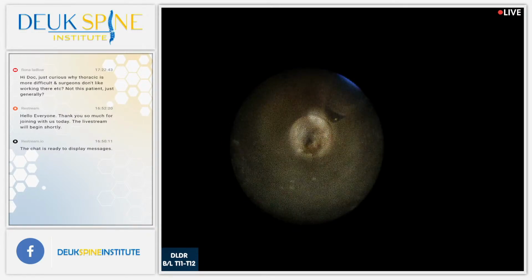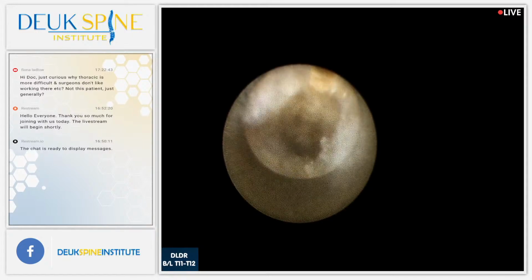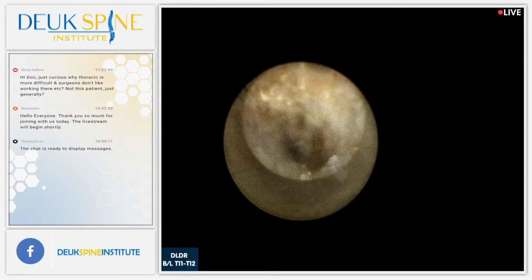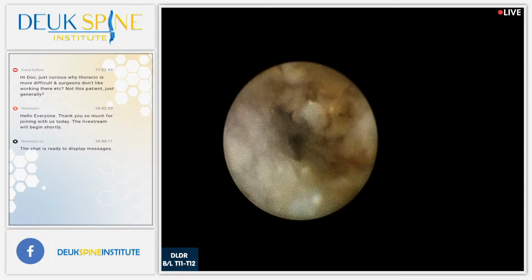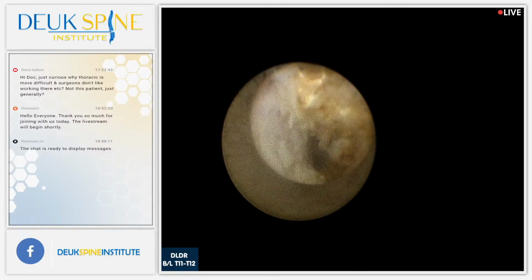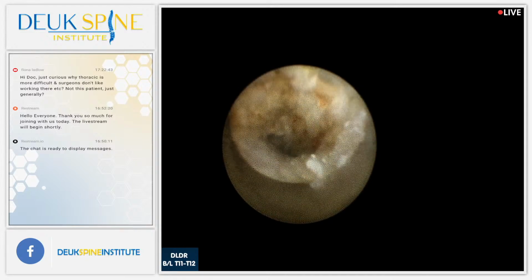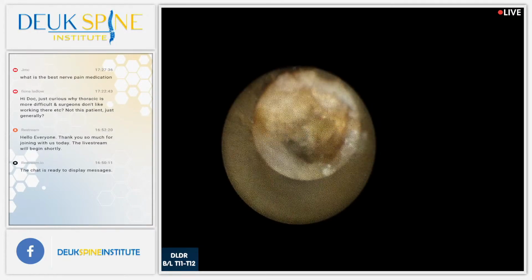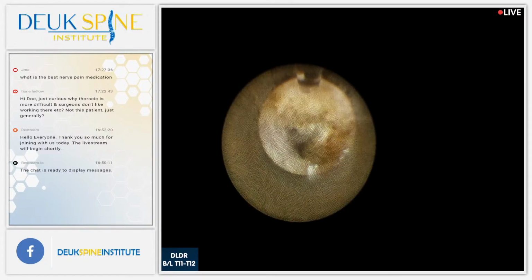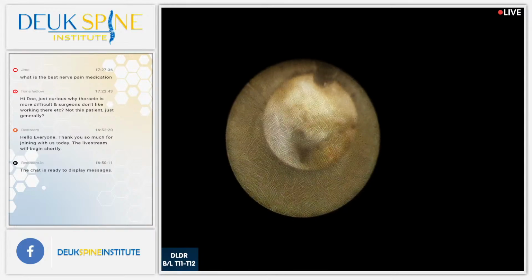All right, so I'm inside the herniation right now, and I'm literally using the laser to break it up into pieces. I'm trying to chop off as much as I can. I won't get it all. And tell everybody I'm not going to get all your herniation, because I can't. It's not possible. Nobody can, by the way. See, this is better, Luis. For this particular patient, at this particular disc, it's just a better thing. I think it's always good to try to get the larger scope if we can, but you got to look at the disc and say, how much of this can we really get? Is this disc collapsed? If the disc is too collapsed, we got to go with the smaller scope. In her case, her disc here is pretty collapsed. So I think it was a good try.